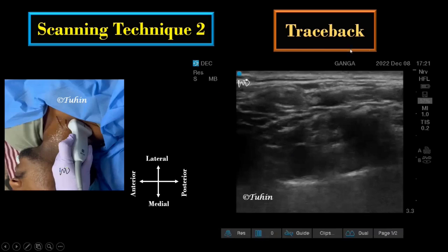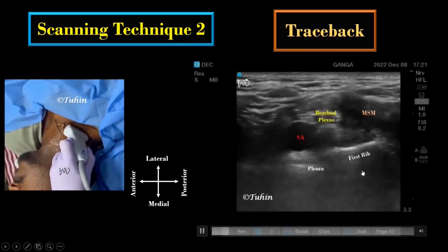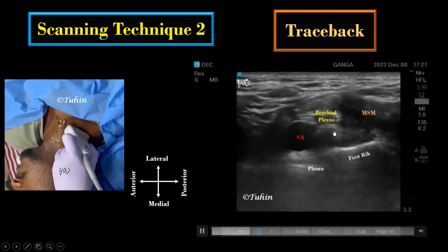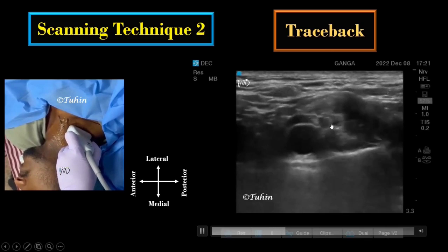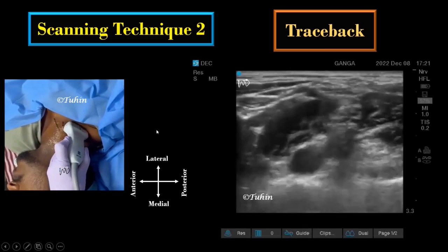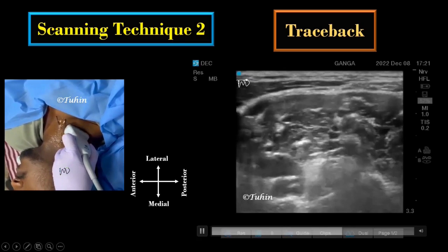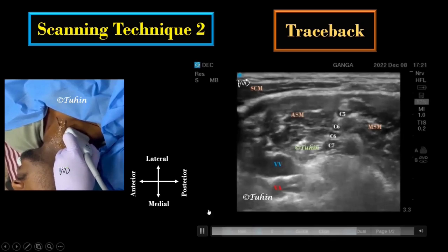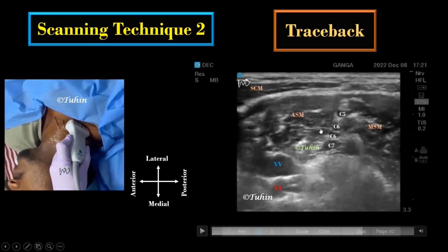This technique is also known as the traceback technique because the interscalene brachial plexus is traced back from the supraclavicular area. Scanning starts at the supraclavicular fossa — identify the brachial plexus posterolateral to the subclavian artery, then move the transducer in the cephalad direction to identify the brachial plexus elements between the anterior and middle scalene muscles.